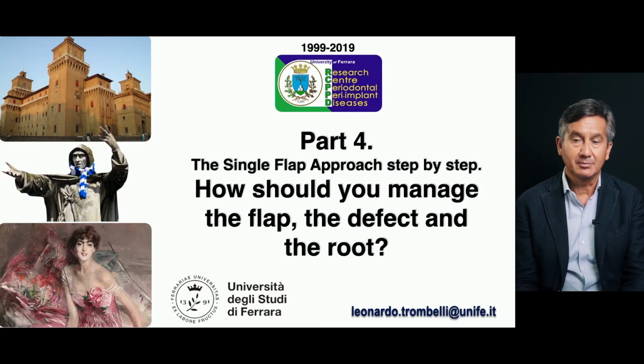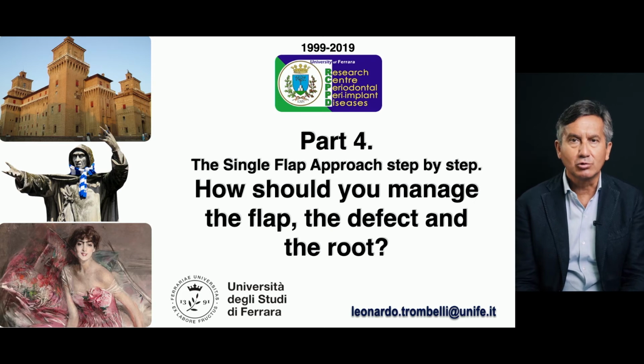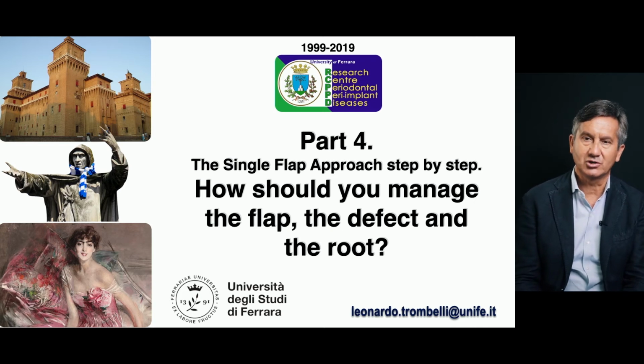In part 4 and part 5, we will see how to perform the single flap approach step by step. In part 4, in particular, we will focus on the way to manage the flap from the incision line to flap elevation and how to deal with the defect debridement and the root surface decontamination.